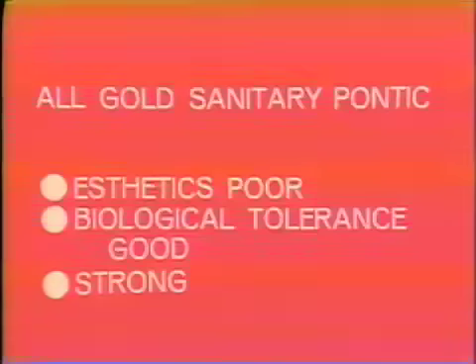Well, just to summarize the main points of the all-gold sanitary Pontics, the aesthetics are not good. The biological tolerance of these, so far as the tissues of the mouth are concerned, if they're well polished, if they're a good casting, the biological tolerance is good. They have the great advantage, of course, of being strong. They resist the many forces and so on that fall upon them in the posterior mandibular region extremely well.